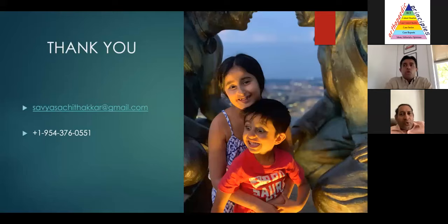OrthoSensor? Yeah, I personally don't use it, but a lot of the people in Belgium, and one of the people who trained me, Patrick Meere at NYU, have extensive experience with this. And I think that if your hospital had to invest in one type of technology, I would say that is a fantastic device, because it gives you such real-time data. Now, the question is, how reliable is that data when it comes to different implant systems? Because pressures in a Smith and Nephew may be different than in a Stryker or a DePuy. How can you correlate that with preoperative pressure? That's, I think, the key. If you can say this is the preoperative pressure, this is the intraoperative pressure, and now we have a postoperative pressure, somehow we can measure that. I think that will be our answer in some ways.